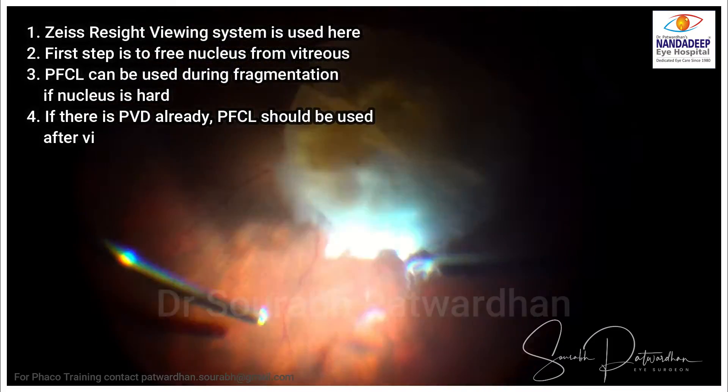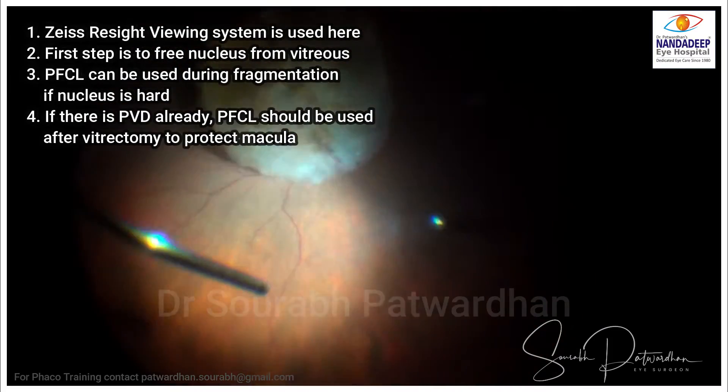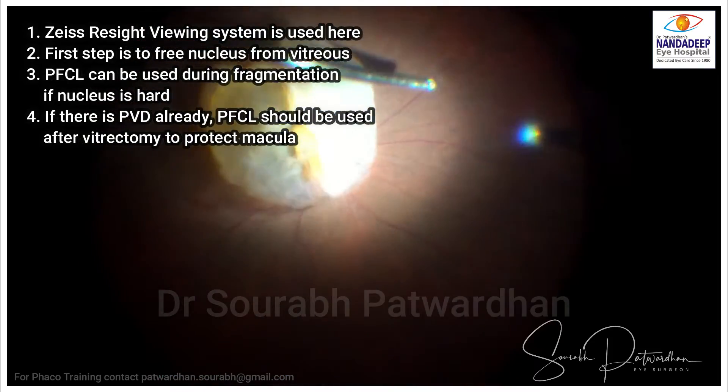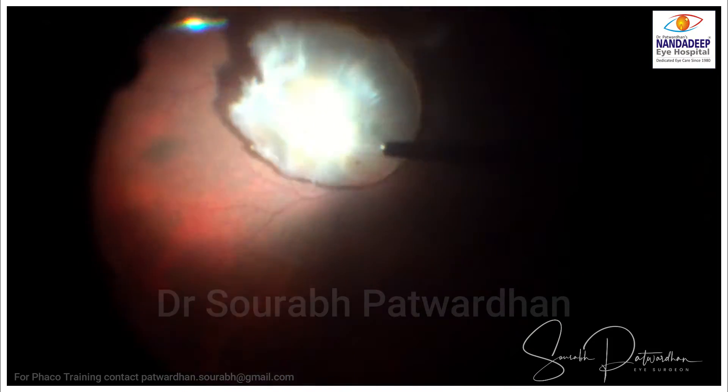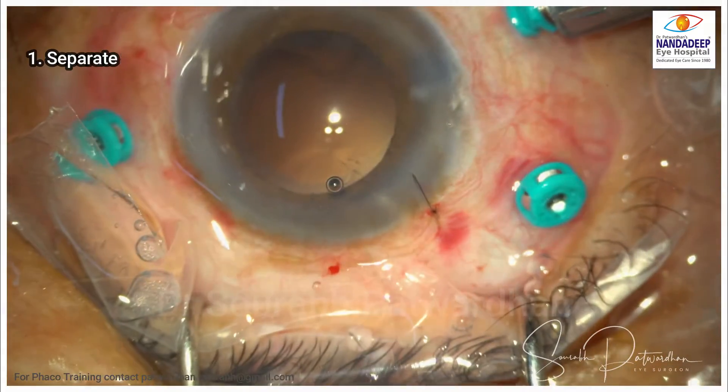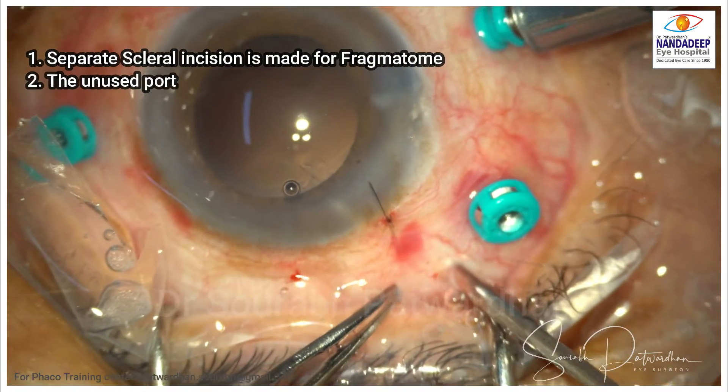The Zeiss Resight Viewing System is used here. The first step is to free the nucleus from the vitreous. If PVD is present, we can use PFCL to safeguard the macula. Whenever there is a harder-grade cataract, I always use PFCL.